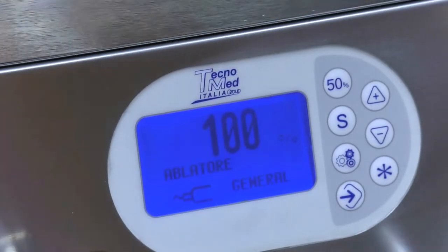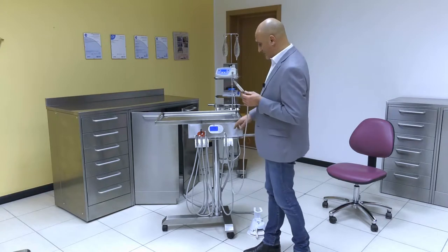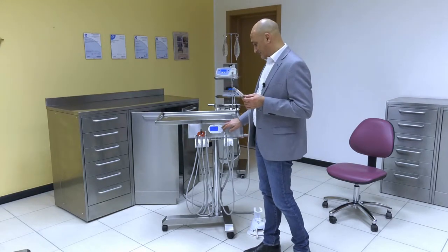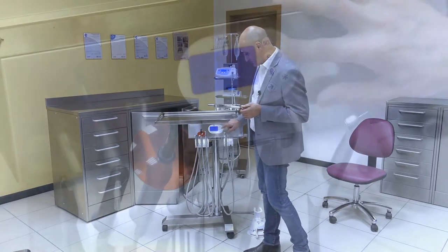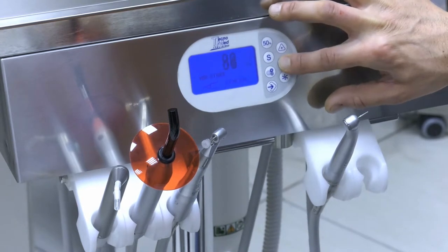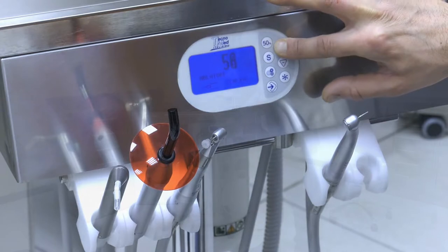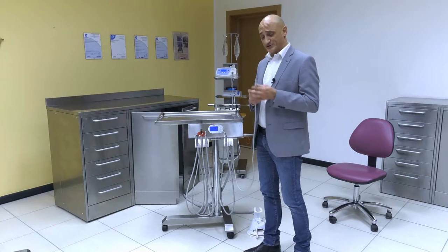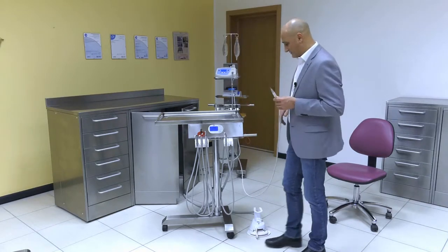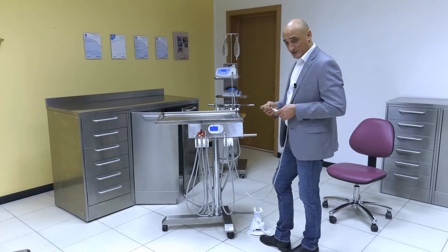Let us have a look now at the ablation tool. The ablation tool, much like the micromotor, can be adjusted in terms of maximum power, which can be adjusted from a maximum of 100% power down to lower percentages by operating the minus button. As you press the 50 button, the maximum power of the ablation tool moves immediately down to 50%. Once again, by operating the lever, you can engage the ablation tool.